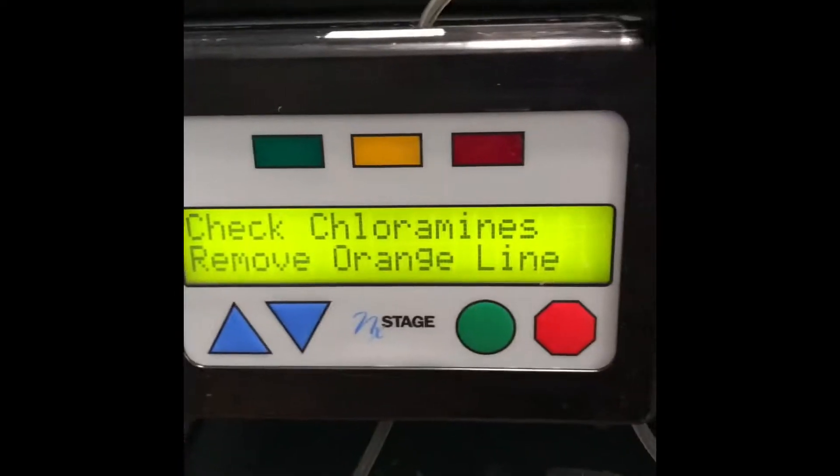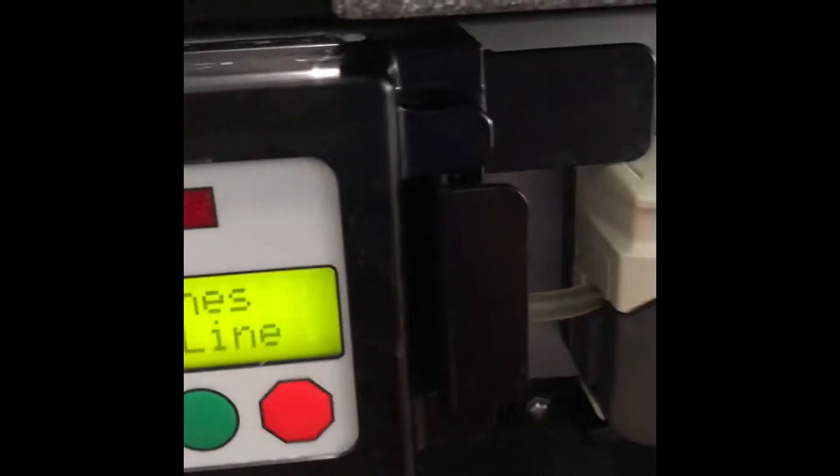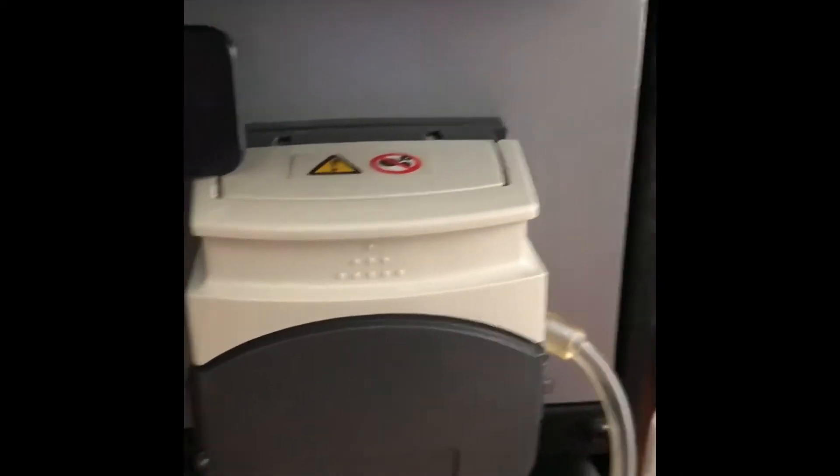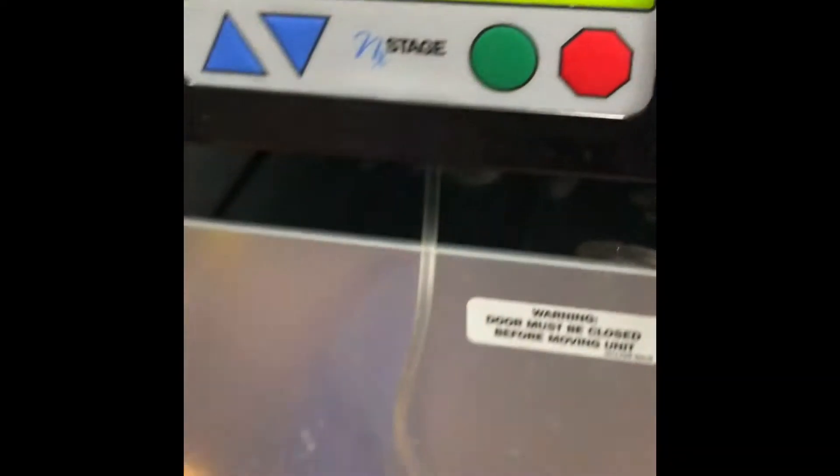Good afternoon, guys. I am checking my chloramines, which is checking the water content after I made a batch, which took about seven hours overnight. So I am going to show you how that's done.